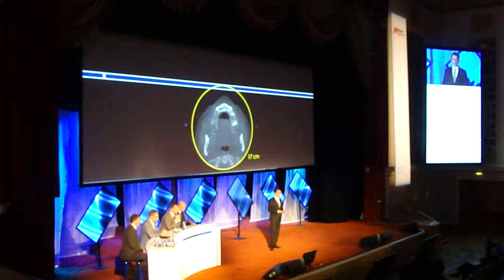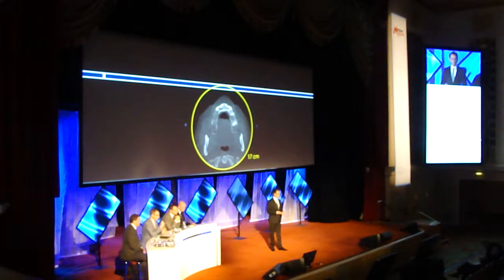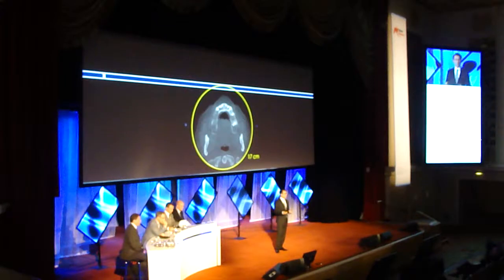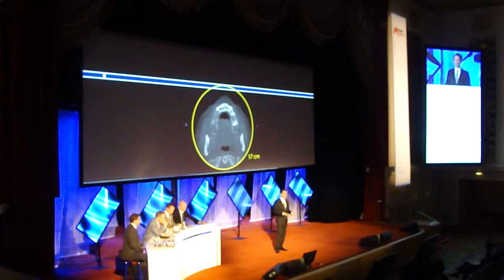This is an example of a craniofacial study through a patient's head. You can see that it captures the entire edentulous maxilla, as well as both mandibular rami, and then posteriorly to the cervical spine. So it's a very, very large area.